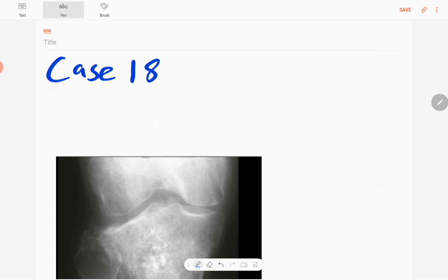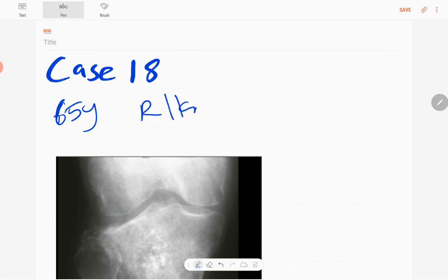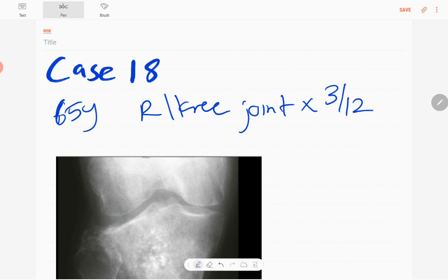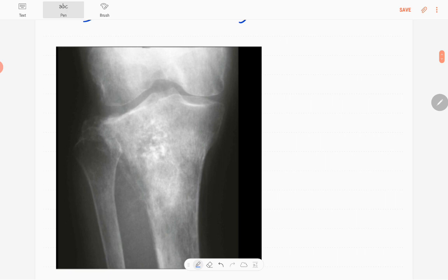Hello everyone, this is case number 18 of the MSK series. Today our case is a 65-year-old patient presented with right knee joint pain for three months duration. This is the anteroposterior radiograph of the right upper tibia and fibula including the knee joint in a skeletally mature patient.